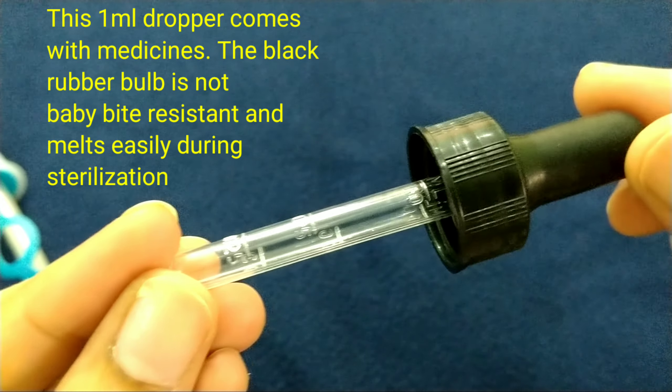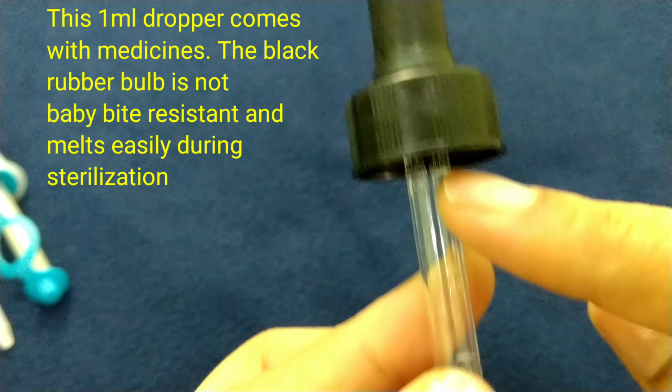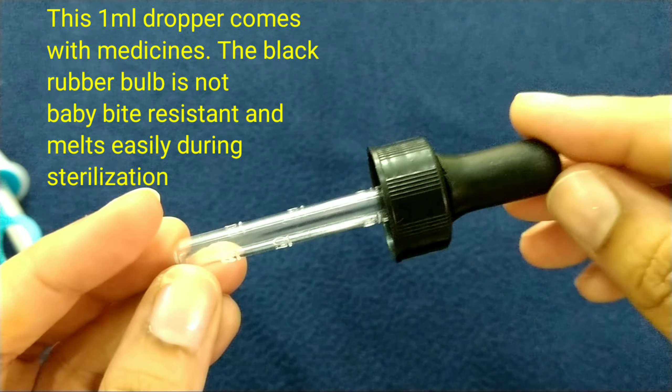First, I am going to show you the 1 ml medicine dropper. I am going to show you how to use the sterilized dropper.